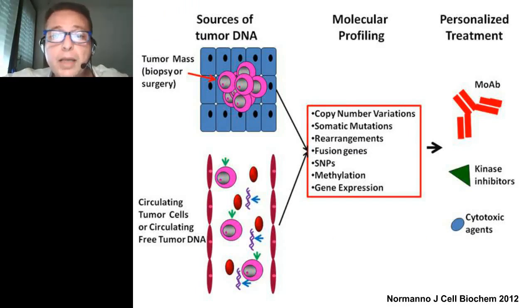What we believe is that having these tools available, which allow us to perform a complete molecular profiling of a tumor, starting even from a very small amount of DNA, and hopefully in the near future starting from circulating free tumor DNA, or even from DNA that we can extract from circulating tumor cells, we can provide a complete molecular profiling of the tumor, and this might be really useful to realize personalized medicine in cancer patients.